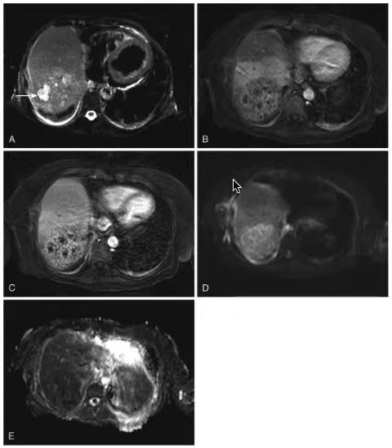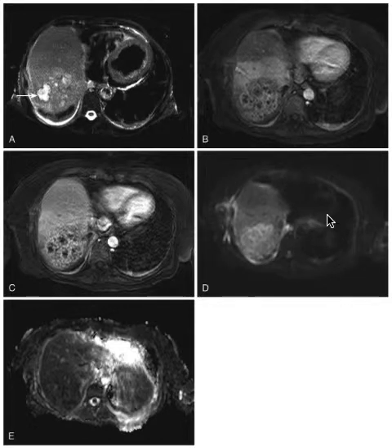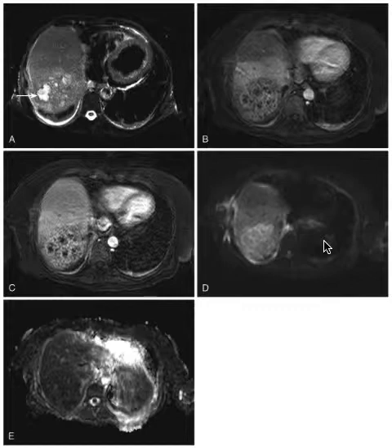Moving to DWI, restricted diffusion is going to be an important characteristic of abscesses. Although in both body and neuro MR, abscesses don't always restrict, especially from different organisms, in general we expect to have restricted diffusion from an abscess.